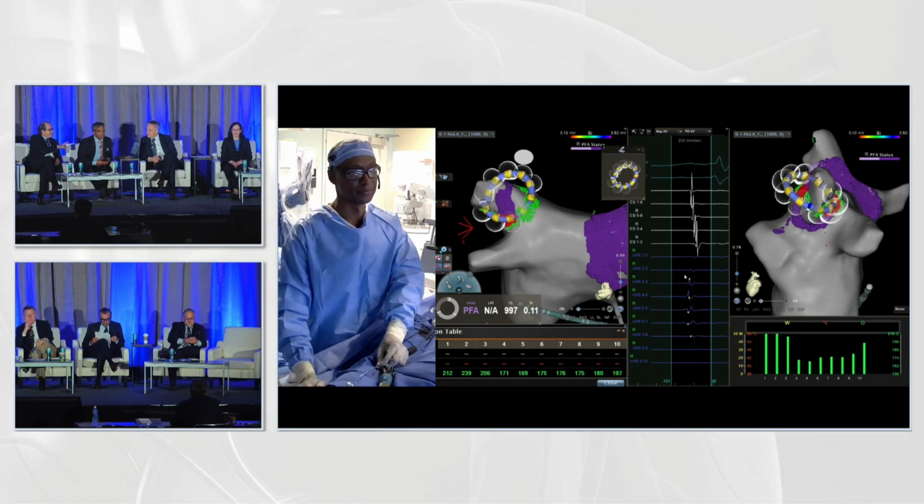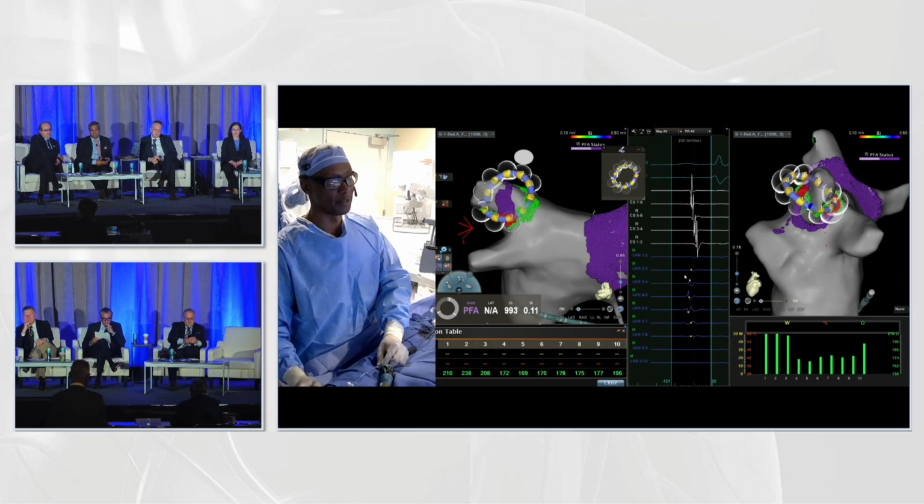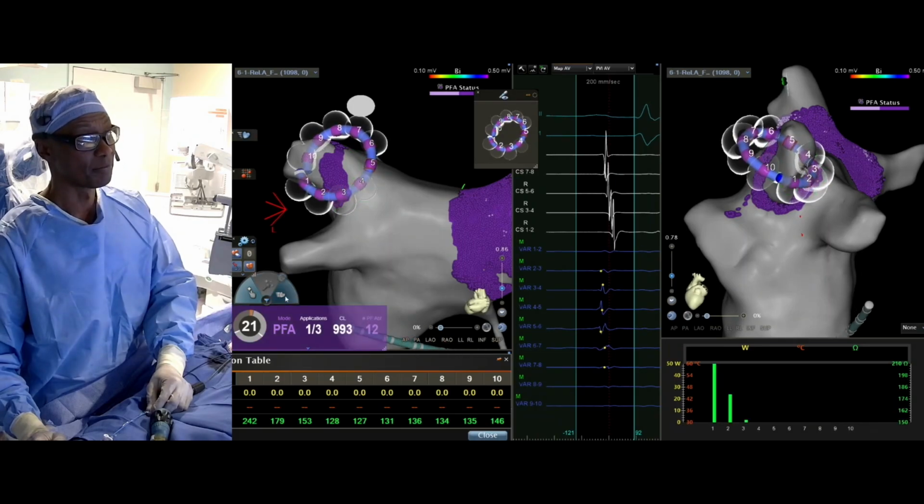So I agree. Charles, we're just over half the time, so please go ahead with the ablation. Okay, we're going to go ahead and deliver the second lesion, which is inside the vein here. Go ahead, Luigi. No, Vivek, you had a question.